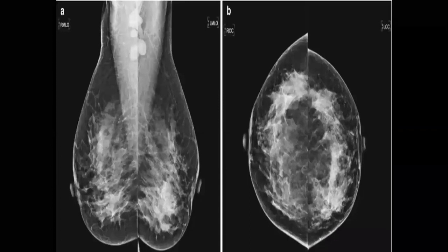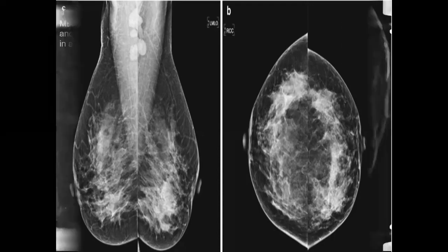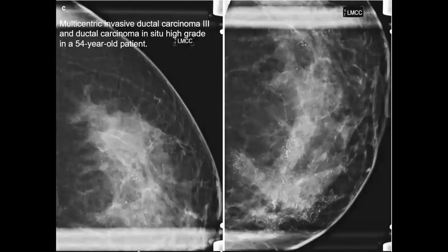Okay, if you look at this dense mammogram, what is the abnormality? Pectoralis. The abnormality, which side, right or left? Left. Here? Yes, quickly. Yes, left. Inferior, inner. Inner, inferior, excellent. Yes, the mammography here shows multicentric invasive ductal carcinoma associated with high-grade DCIS.